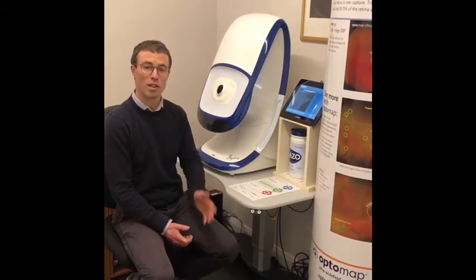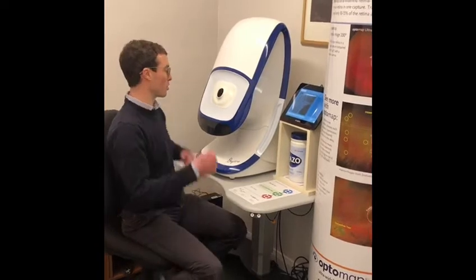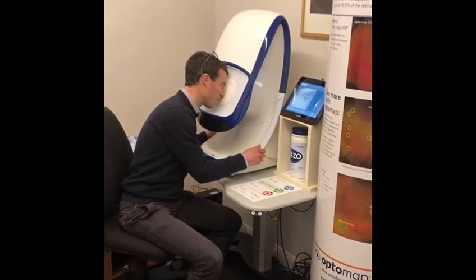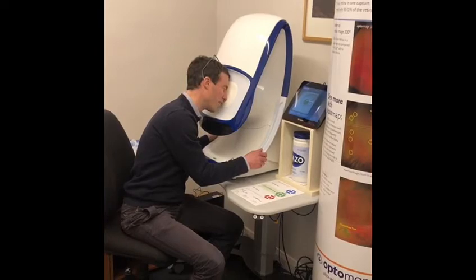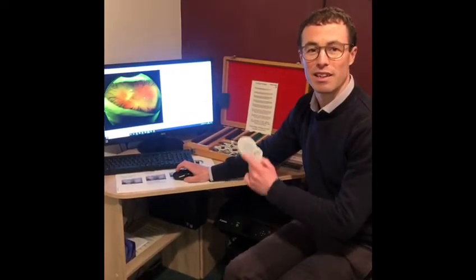So I'll give you a quick demonstration how this works, and then I'll show you the results in the consulting room. So here it goes. Very simple. Line up with the target, and then bright flash, that image is taken. We'll go through and have a look at the results now. So that picture's been done, quick and easy. Let's have a look at the results.